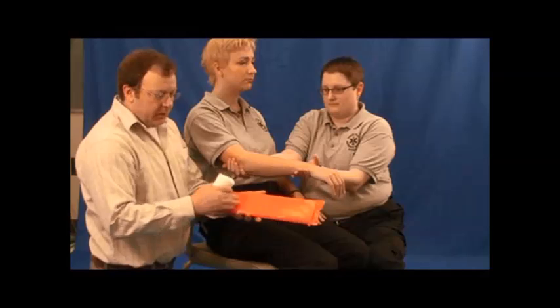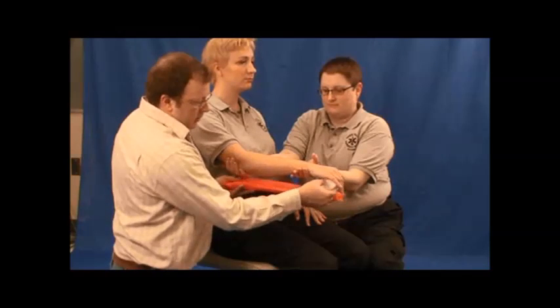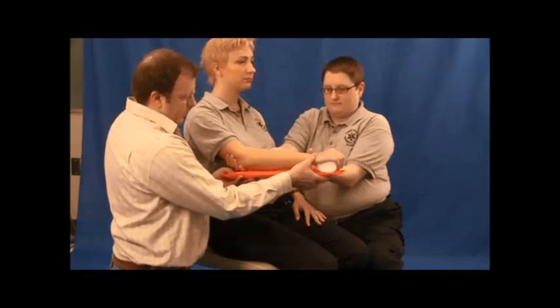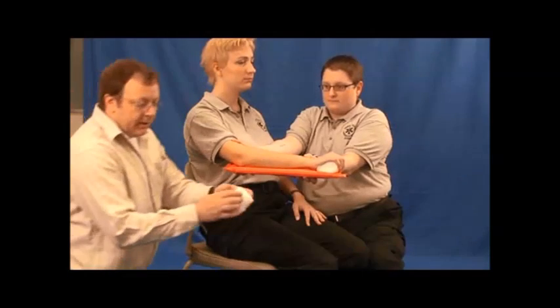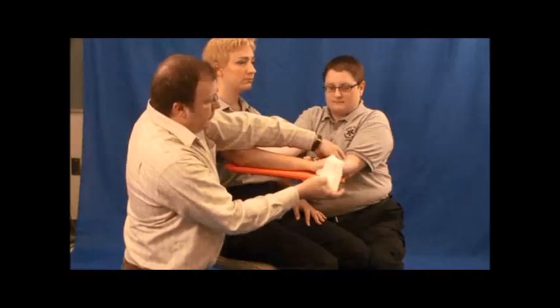Using a padded board splint, pad towards the patient's arm — can you stabilize the board please? We're going to use cling, wrapping from distal to proximal.